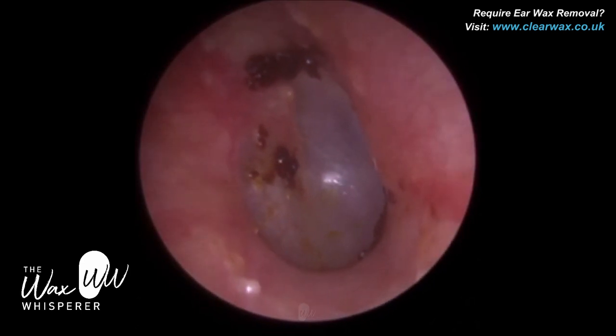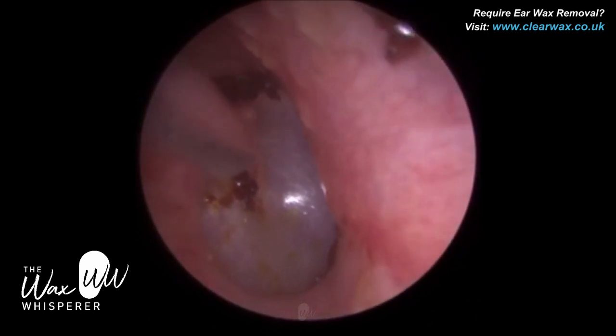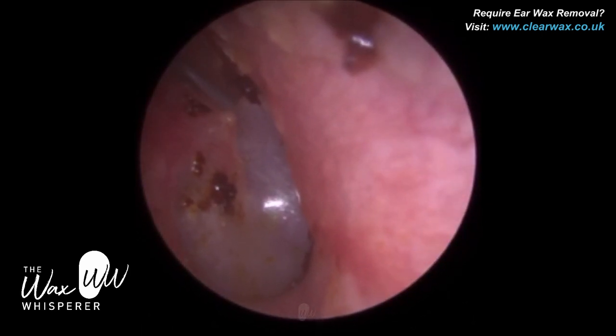So there's still just a little bit now. The patient's symptoms were more or less alleviated at this point. Because the patient is very still and I felt very confident, I thought, let me just get this wax off the attic.